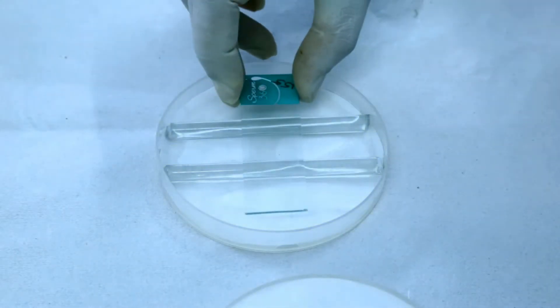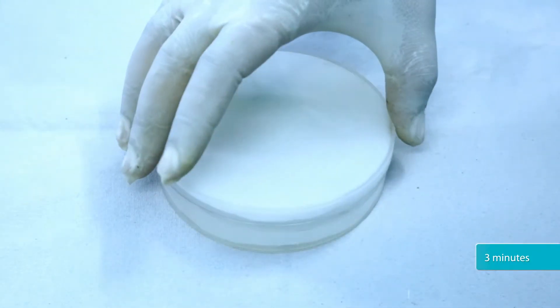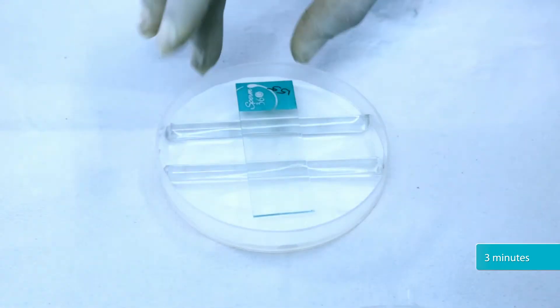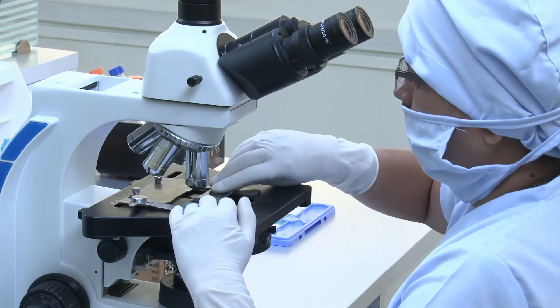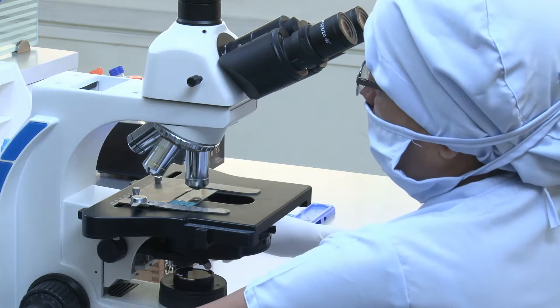Place the slide in the petri dish and incubate for 3 minutes. After 3 minutes, observe the smear under phase contrast microscope using the 40x objective lens.